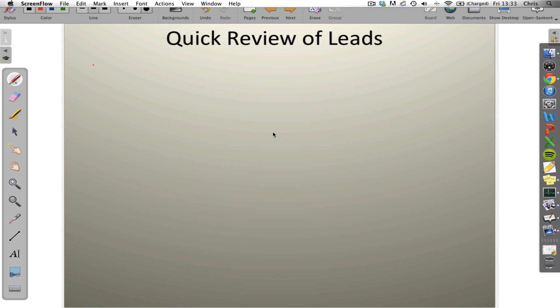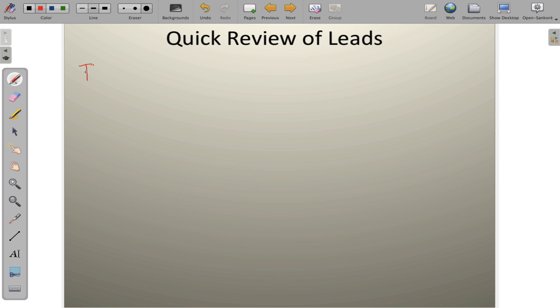Greetings, everyone. In this video, we'll explore how to determine the overall QRS axis on the 12-lead EKG. One method of doing that is called the quadrant method, where we establish a four-quadrant system by using two specific leads — leads 1 and AVF.